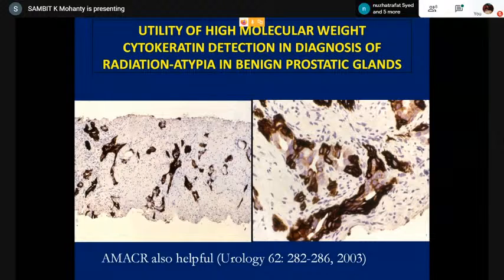Why? Because prostatic adenocarcinoma is a small gland disease. The glands are small, infiltrative, going in between the larger glands, whereas PIN is a large gland disease. When the gland is big, hyperplastic, large, that is affected by PIN. A small gland disease is not PIN. So the matter ends there. PIN is not a differential diagnosis of prostatic adenocarcinoma.